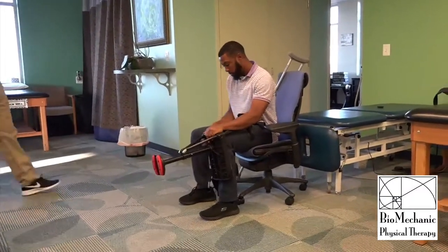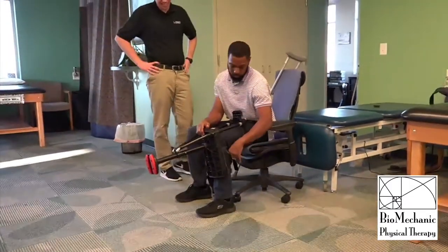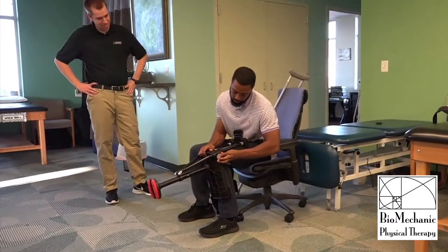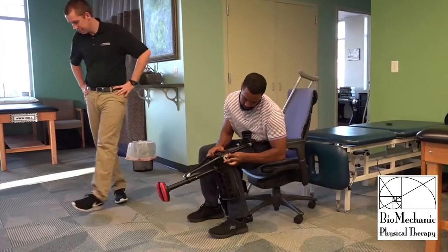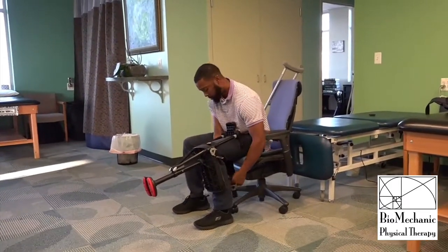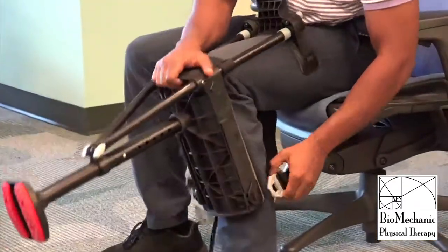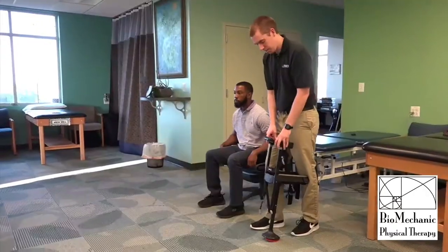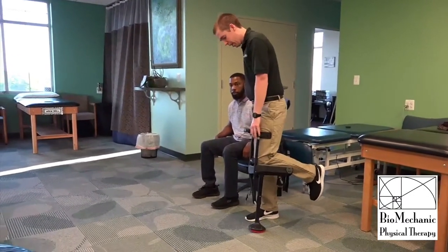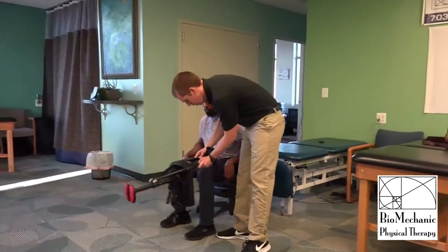Now here we have Dion going to try to put it on himself — it's his first try again. A little tricky but I think you'd get it. Now Danny's going to get involved and give that a try, strapping it on while sitting instead of standing.